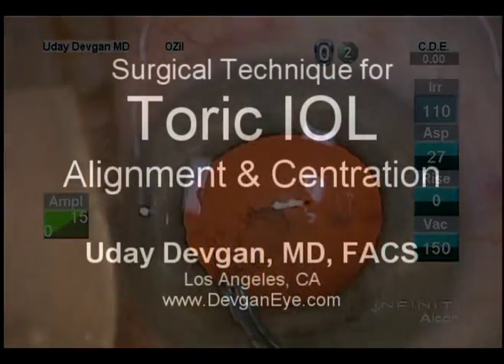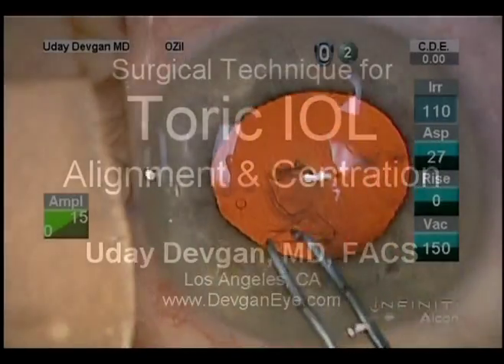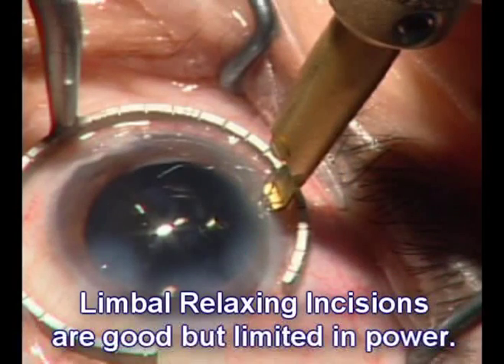Surgical technique for toric IOL alignment and centration. For astigmatism, limbal relaxing incisions are good, but limited in their power.